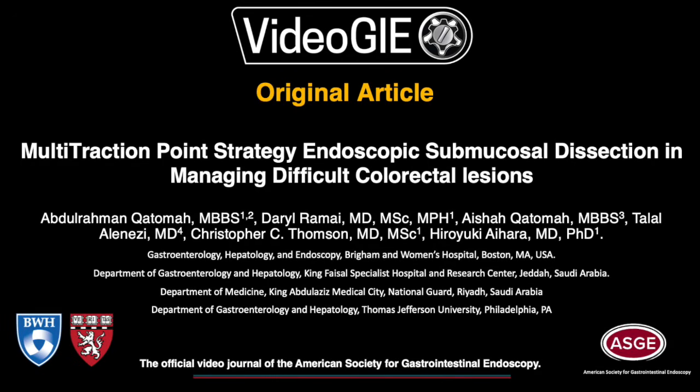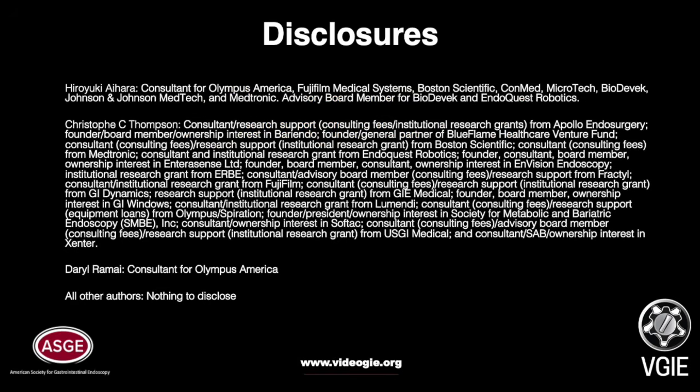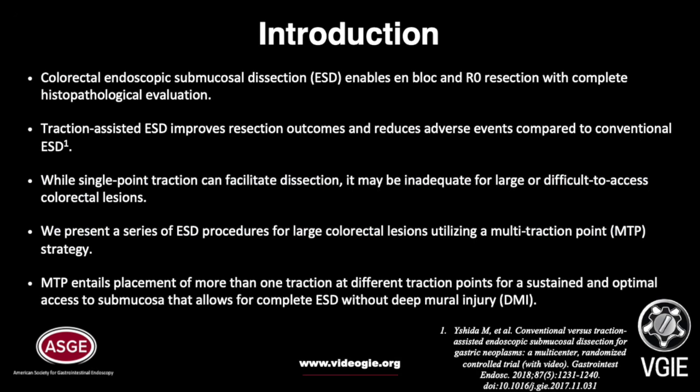Multi-traction point strategy endoscopic submucosal dissection in managing difficult colorectal lesions. Colorectal endoscopic submucosal dissection enables en bloc and R0 resection with complete histopathological evaluation. Traction-assisted ESD improves resection outcomes and reduces adverse events compared to conventional ESD. While a single-point traction can facilitate dissection, it may be inadequate for large or difficult-to-access colorectal lesions.